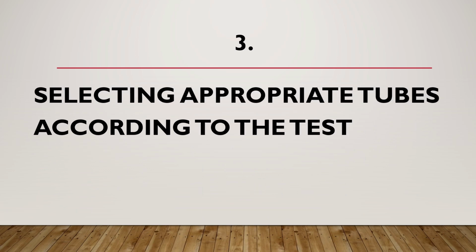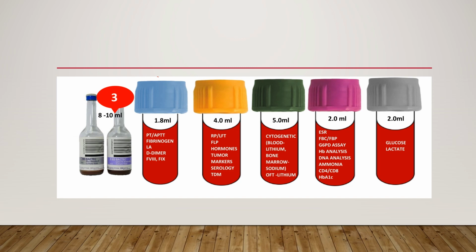Then, tubes are selected according to the test requested. Sample requirements differ depending on whether the test request is for virology, serology, clinical biochemistry and/or hematology. The quick guide for various applications is listed as below. However, it is recommended to refer to our lab handbook for further details of the test requirement.